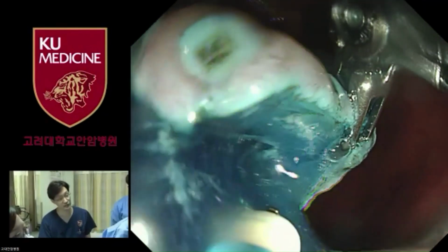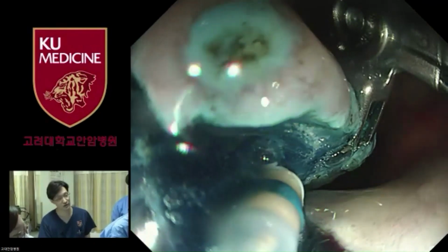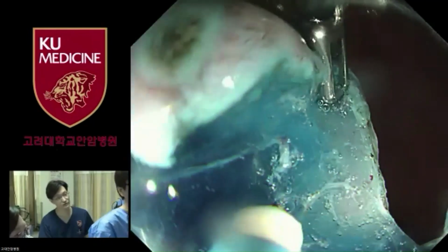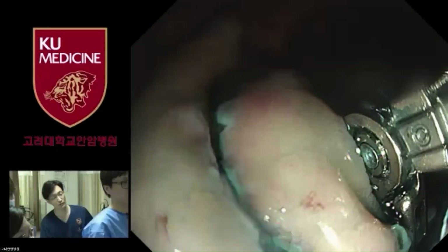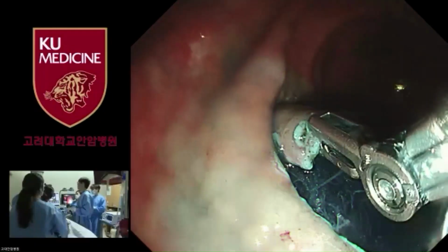For dissection time, we need more cases to see the absolute effect, but as for the reduction of blind type dissection and the clinical outcome, it works, I think. But I feel it also helps for bleeding, because you have more room to see where the bleeding is coming from, and you're not covered by the blood.